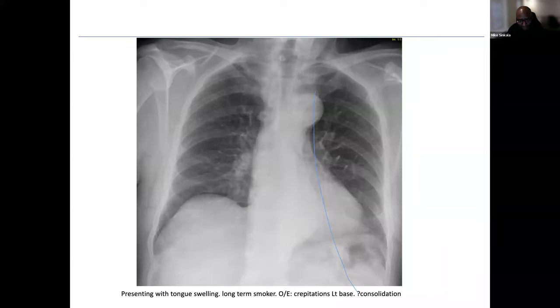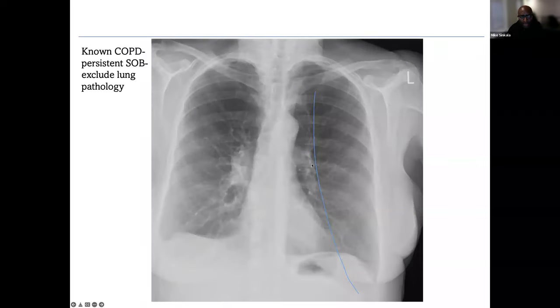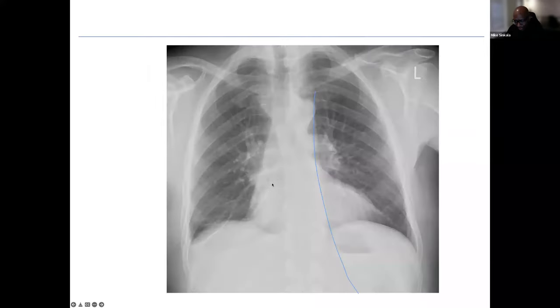I think we spoke about this last time. Notice also on the PA projection, you must make sure that you can see through the heart to see the spine. But what is of interest here is that we do have the ectatic descending aorta here. So there is actually something going on here with the aorta. Does it need further investigation? Possibly yes, because this could be an aneurysmal descending thoracic aorta. This is just talking about hilar enlargement, which is the CT showing that.